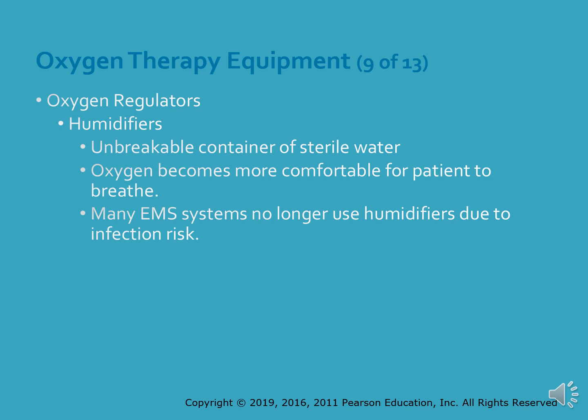A humidifier is an unbreakable container of sterile water that can be placed in line between the flow valve and the oxygen delivery system. As the oxygen from the cylinder passes through the water, it picks up moisture from that water. In turn, the oxygen becomes more comfortable for the patient to breathe. Non-humidified oxygen delivered to a patient over a long period of time, which is usually more than 20 minutes, will actually dry out the mucous membranes and passages of the upper airway. For the short period of time in which the patient receives oxygen in the field, this is usually not a problem.